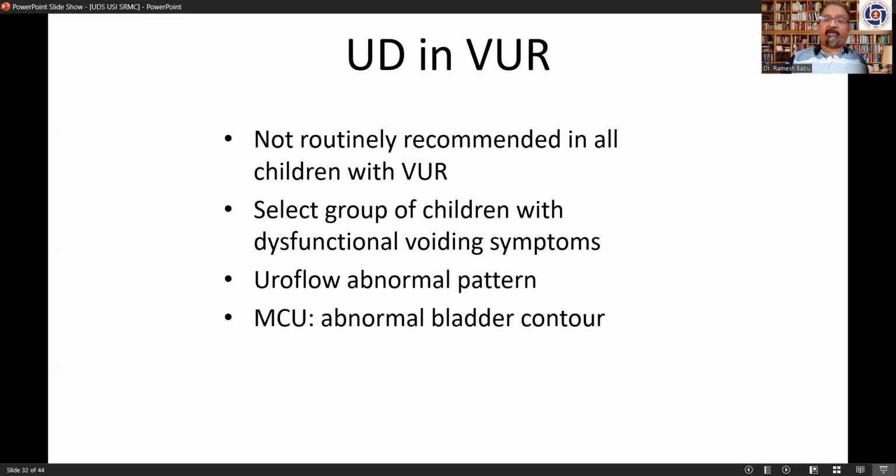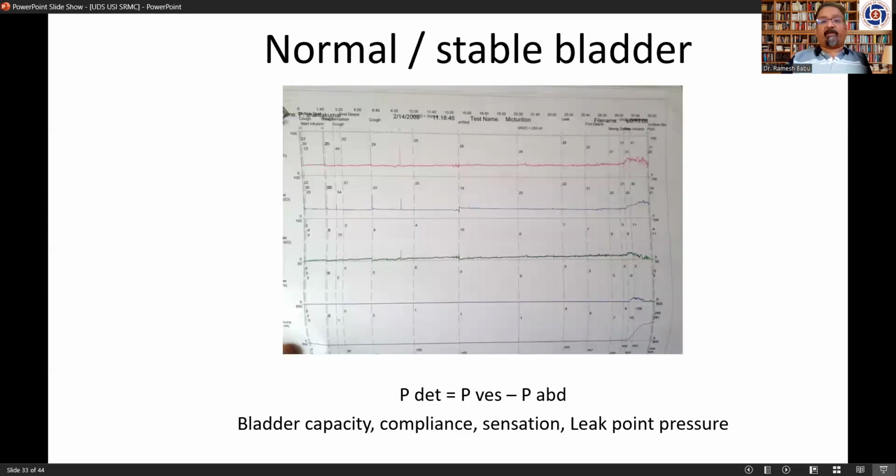So as I said already, urodynamics in VUR is not routinely recommended in all children. A select group of children with dysfunctional voiding symptoms alone are the ones who warrant urodynamics in VUR. Uroflow itself may find a dysfunctional voider, and MCU can reveal an abnormal bladder, and in select patients, you can do a filling phase study.